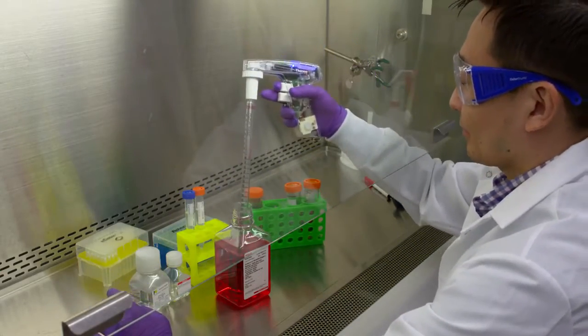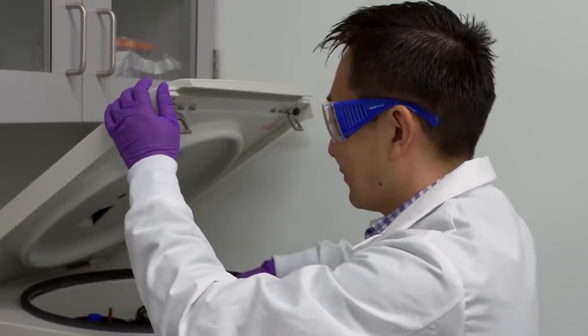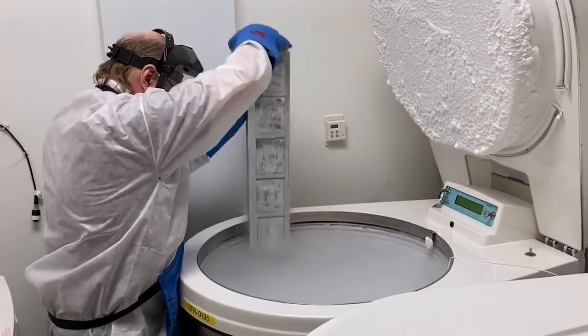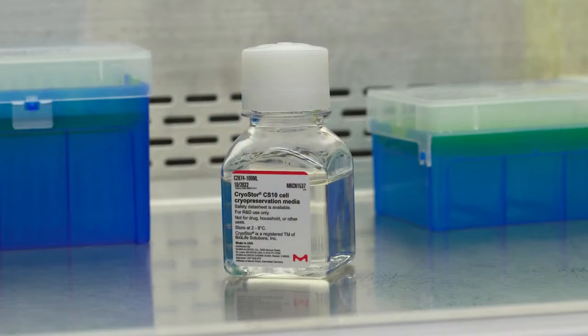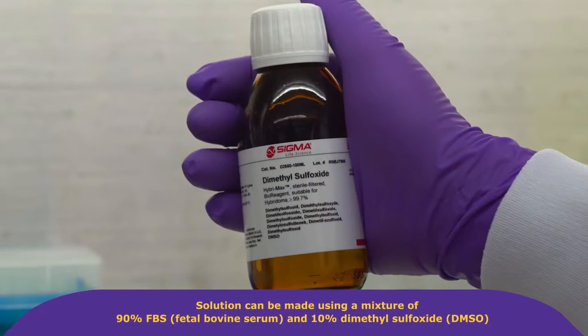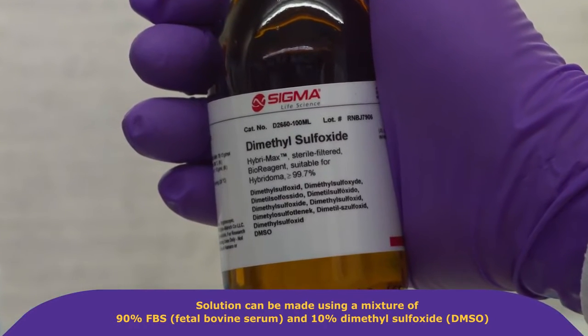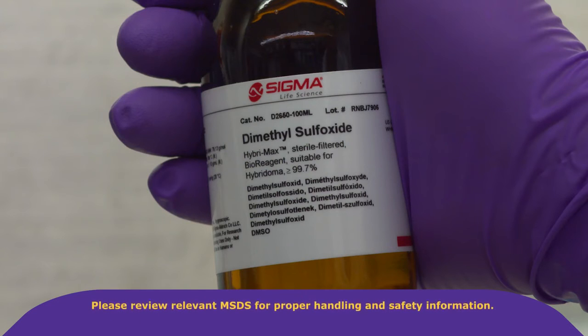So how do we do this? To get started, always wear proper protection equipment to protect yourself from risks associated with mammalian cell culture and handling liquid nitrogen specifically. Cells are stored in freezing media. Commercial products such as CryoStar are available, or the solution can be made using a 90 to 10 mixture of sera and dimethyl sulfoxide, commonly known as DMSO. DMSO is a cryoprotectant compound that readily diffuses through skin. Please review relevant MSDS for proper handling and safety information.